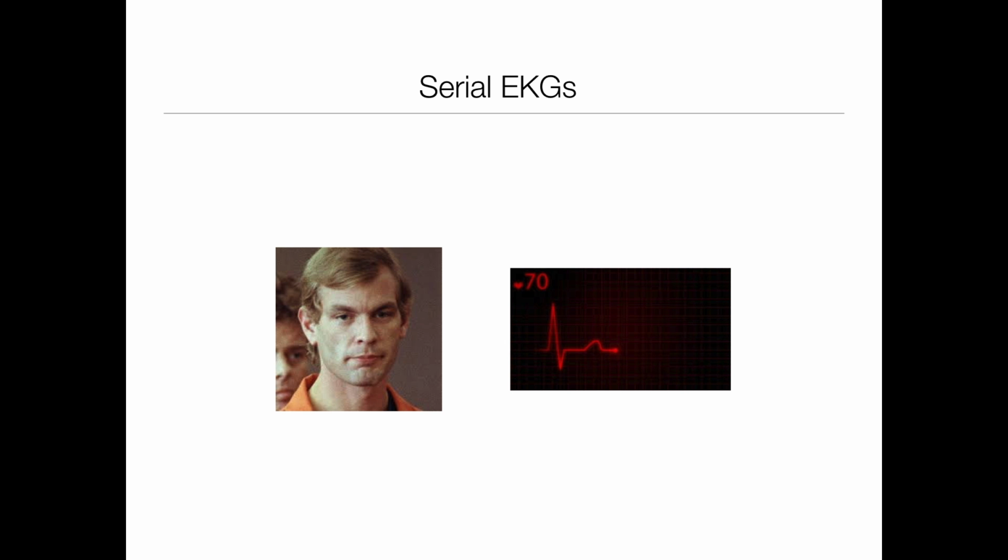And hey, if there's any doubt, don't forget, get a serial EKG. Repeat it in 10 minutes. Check to see if there's been any significant change. EKGs are cheap and painless. Don't hesitate to get another if you think it will help to clarify the diagnosis.